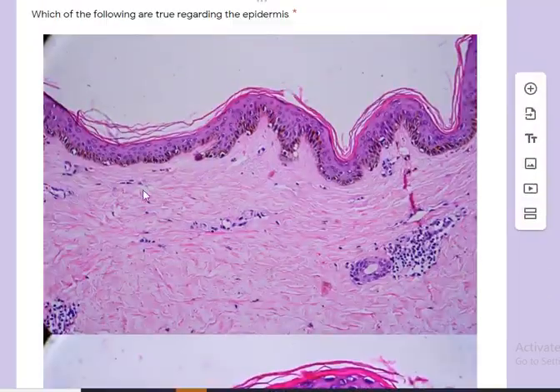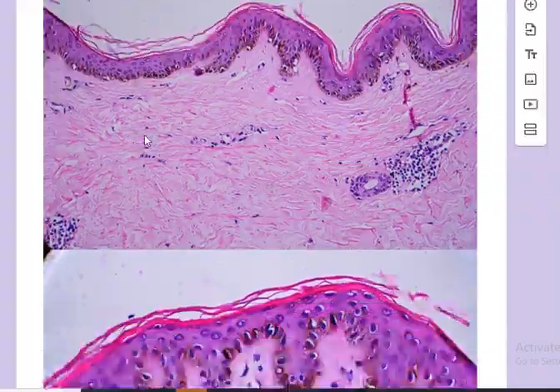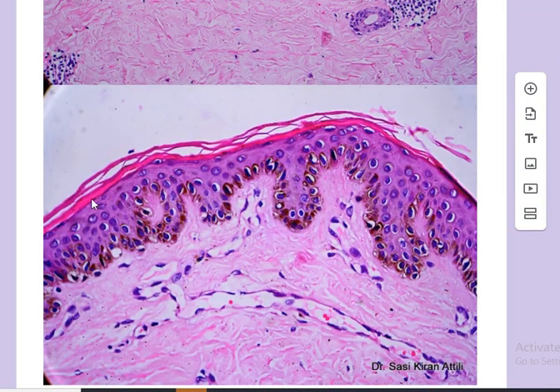And the epidermis, as I told you, has a bit of effacement of the rete ridge pattern, and you can see these irregular rete ridges, which makes the point that there was some inflammatory process here. There is basket weave orthokeratosis, that's what you're seeing here. Here you're seeing a bit of stratum lucidum. It's not compact, it's just stratum lucidum that is visible here, and basket weave orthokeratosis. Note the basal hypermelanosis, and an interesting creature here with 2 eyes.